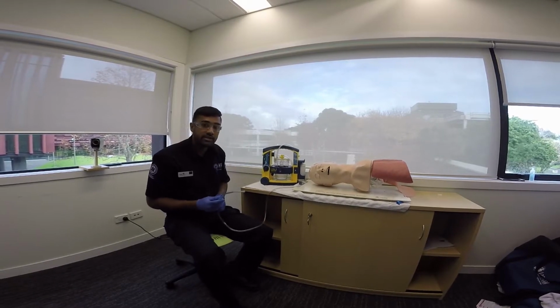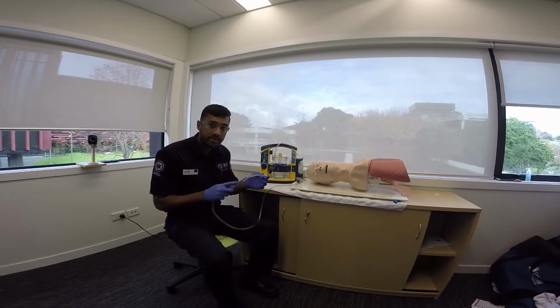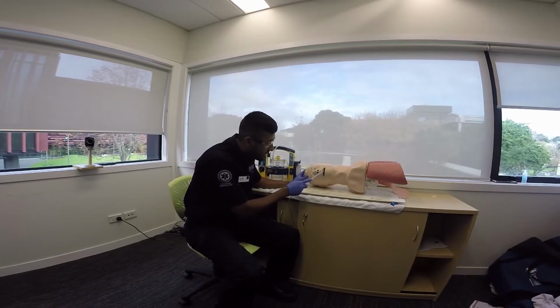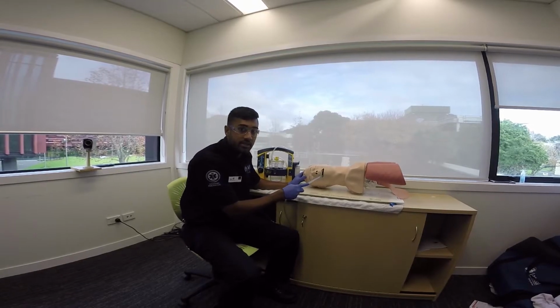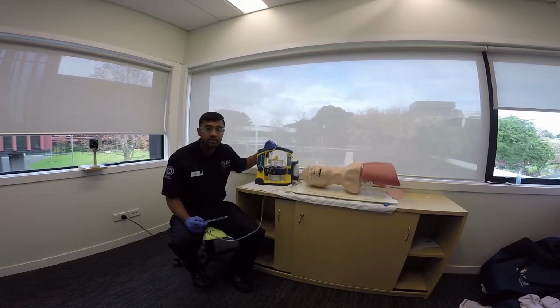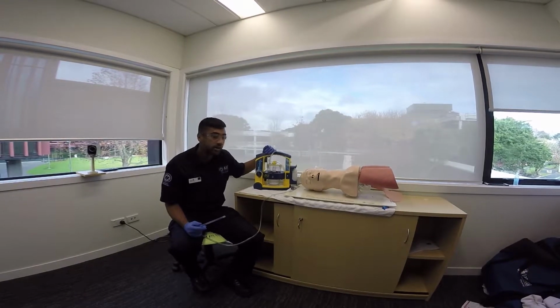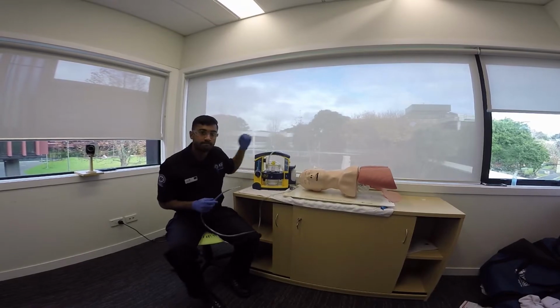Once the primary suction test is done, you want to test it again by blocking the end of the catheter as well as placing your finger here just to create suction. When using it on a patient, you want to enter the oropharynx and use it in a circular motion for a maximum of 10 seconds, only suctioning outwards. Complications whilst using the suction device can include induction of bradycardia, hypoxia, induced vomiting, and some soft tissue trauma. That's why it's very important not to use the rigid catheter in a moving vehicle.